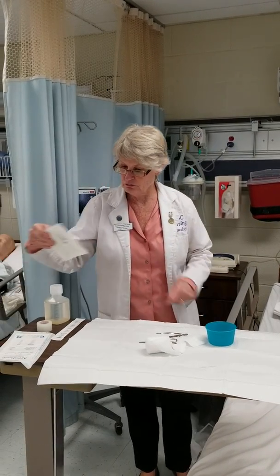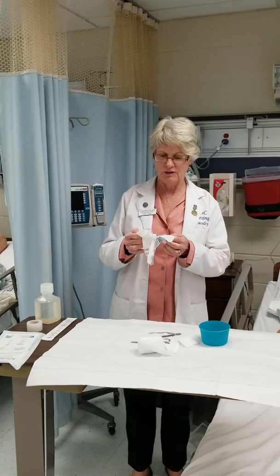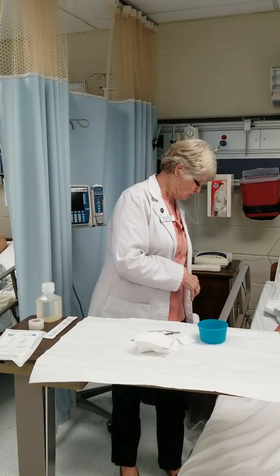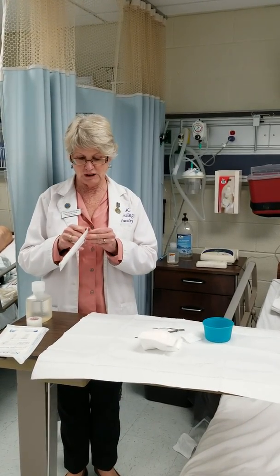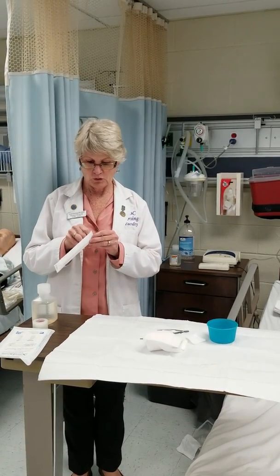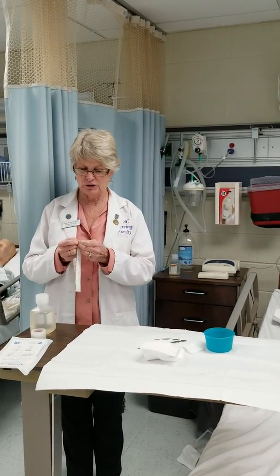I have a sterile 4x4, which I will also need to put on my sterile field. Opening it, making sure I don't touch the insides, and drop it on my field. I also will put my sterile Q-tips. I will need these for later, one for packing the wound and one I can use for measuring the wound as an option. There's another way of measuring the wound, which we can talk about after I complete this.